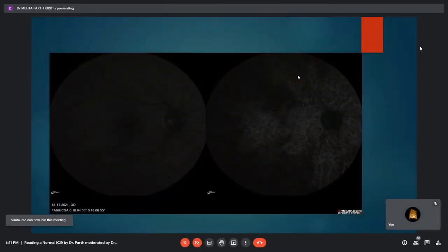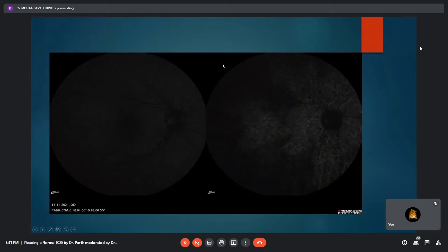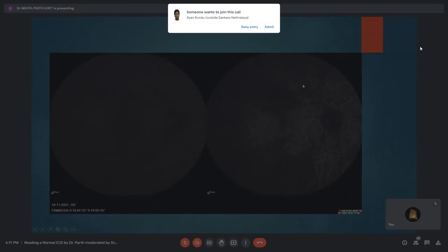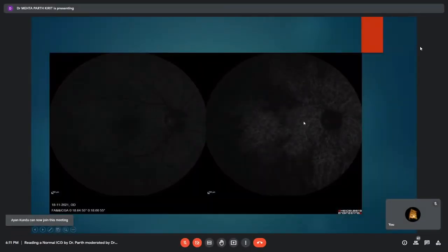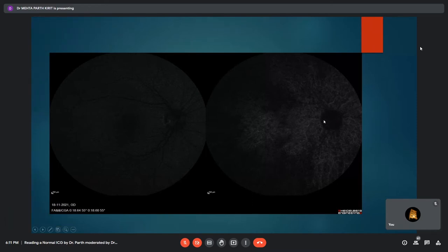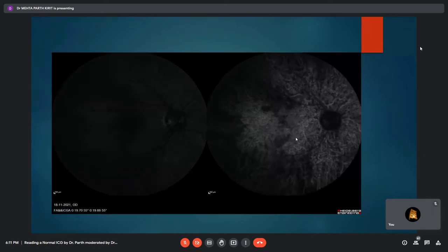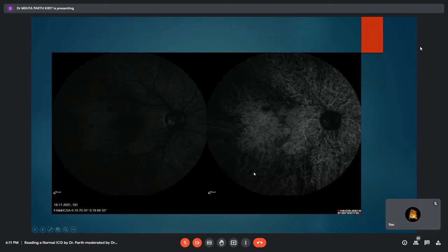In this right eye early phase image, there is early filling of choroidal arteries seen more prominently on the nasal aspect and temporal to the disc, with a relatively hypofluorescent background. A cilioretinal artery has already started filling, visible in both the ICG and the fundus fluorescein angiography image. Proceeding further, the cilioretinal artery can be delineated very clearly, early filling of choroidal veins has begun in the periphery, and vorticose choroidal veins can be seen alongside the early-filled choroidal arteries.